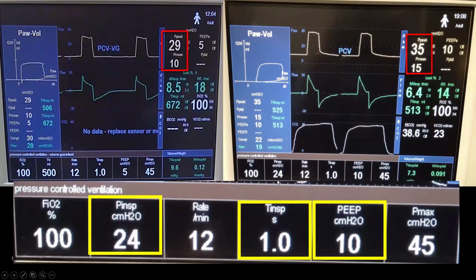And this is when, in some of the old days, they had something called inverse ratio pressure control. They put them in PC and would take the I time out to 2 seconds. The problem with that is patients cannot tolerate holding their breath for 2 seconds on inspiration when they want to exhale after 1 second. So most of them had to be sedated and or paralyzed in order to be synchronized with those kinds of settings.